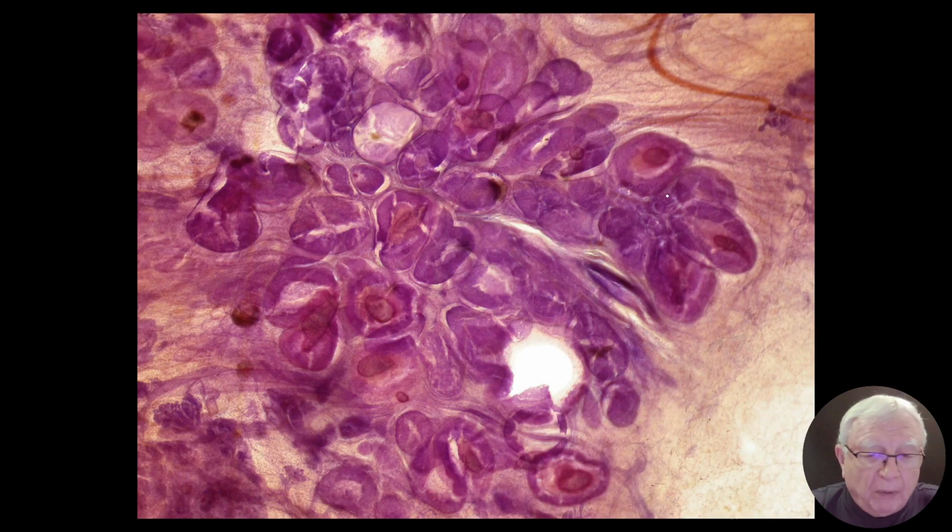Here is the problem with the small section histopathology. The colleagues, the pathologists, are jacking up the magnification factor, and they think that this enormously distended acinus is a duct. Dear colleagues, this is not a duct. This is a distended acinus.